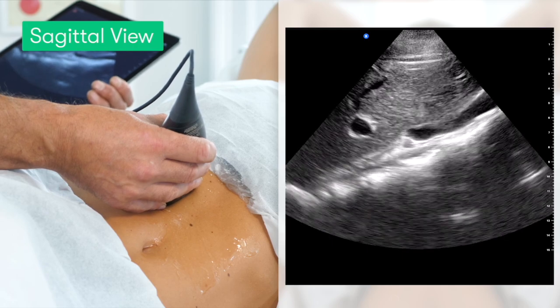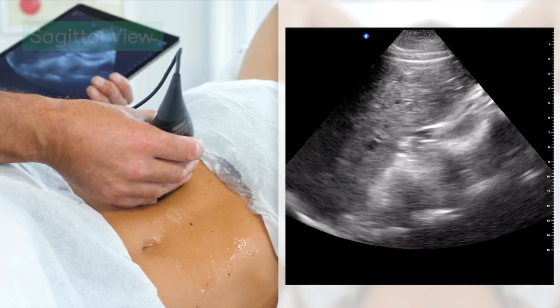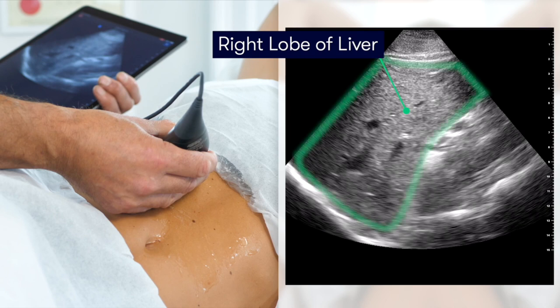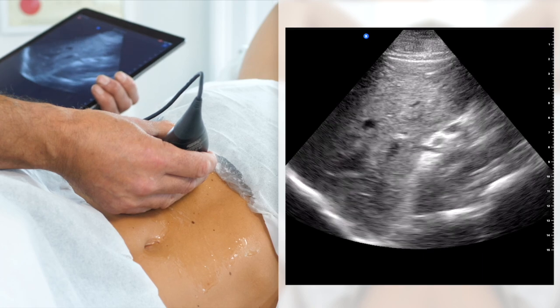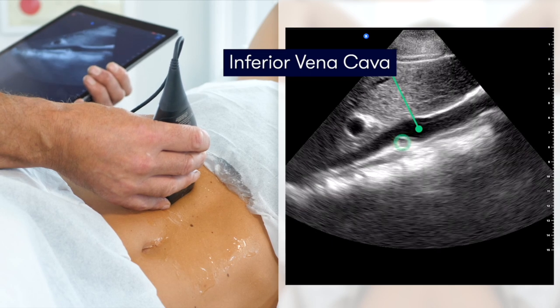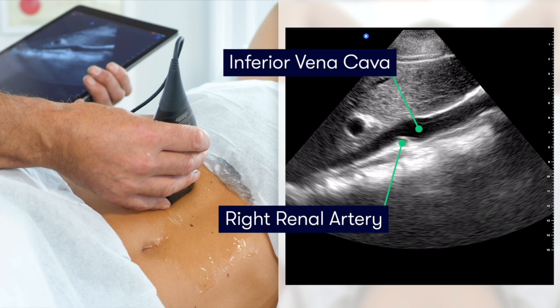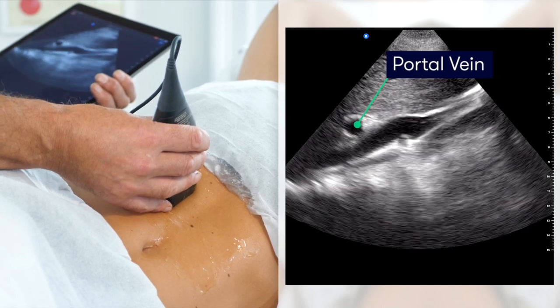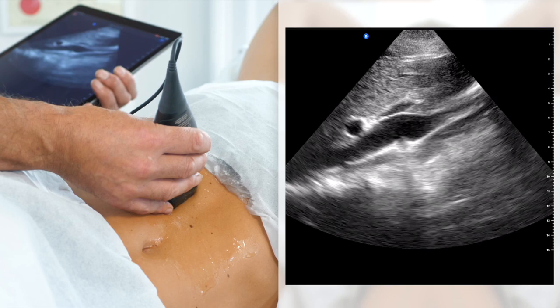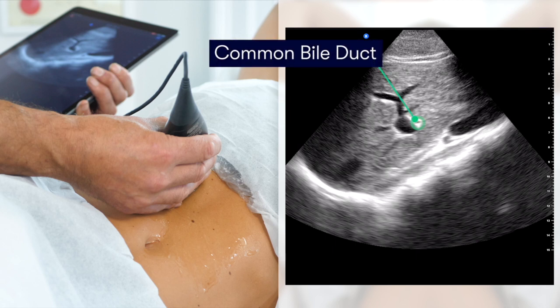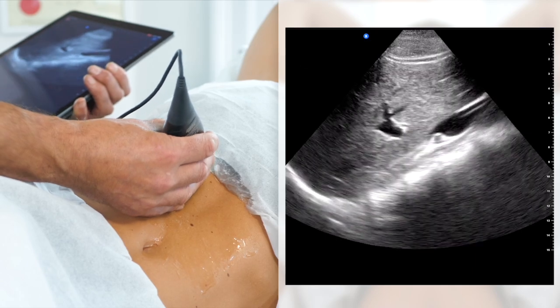Moving back to the liver, to visualise the right lobe of the liver, we turn the patient onto their left side and scan subcostally, initially in the sagittal plane. The liver is a solid organ containing the portal and hepatic veins. As we scan to the left, we can appreciate the inferior vena cava, and just under this is a little round structure which is the right renal artery in cross-section. Within the liver, we can see the portal veins lying obliquely as they come into the liver. Just superficial to this is a small echobright structure which is actually the common bile duct, which as mentioned earlier we would not normally see dilated unless there is an obstruction or the presence of some pathology.